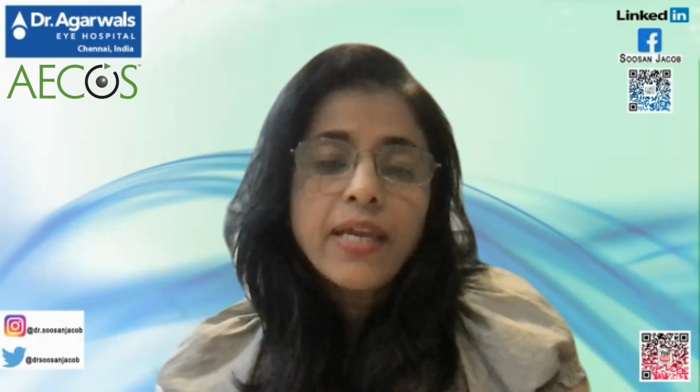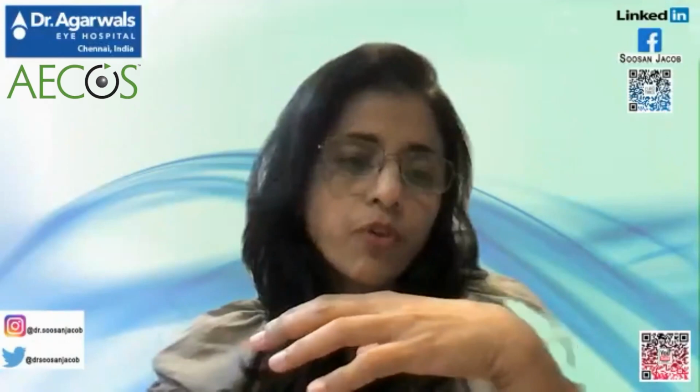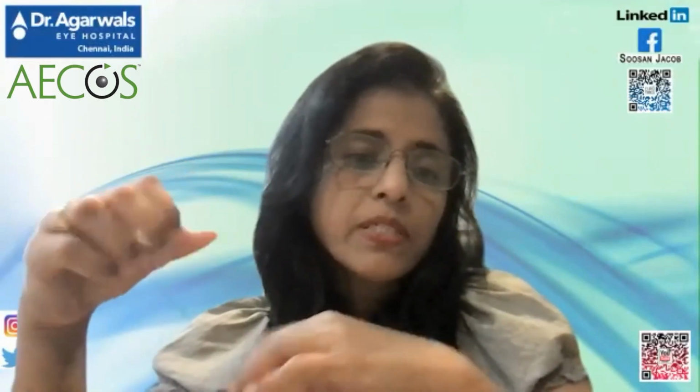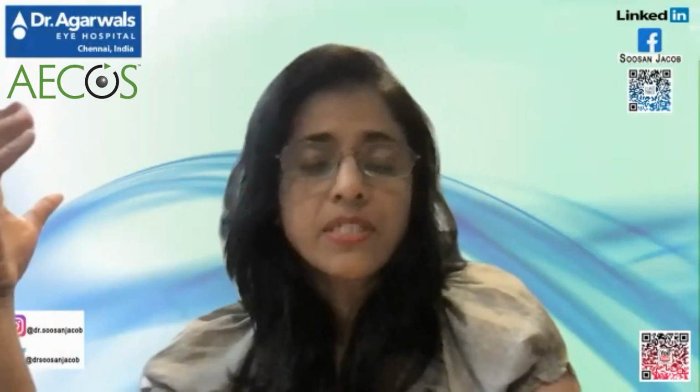Similarly, the 8 and the 9.5 that we have taken gives you thick tissue because it's more from the periphery of the donor. And also the 8 ring is again a commonly used size for DALKs or penetrating keratoplasty. So again, the inner tissue can be used for a different patient if the country's legislation allows.